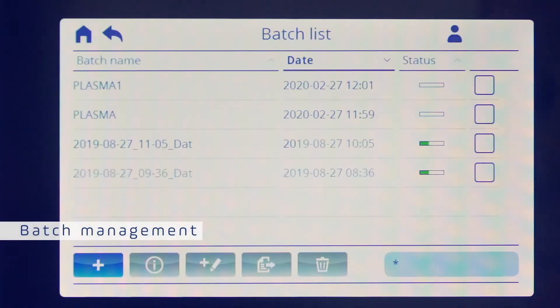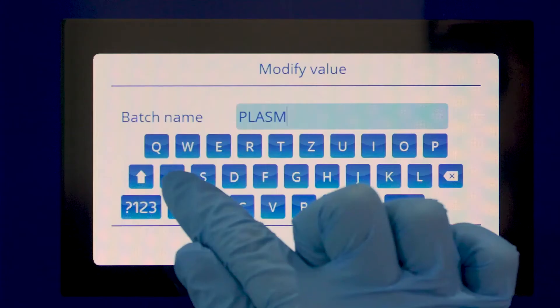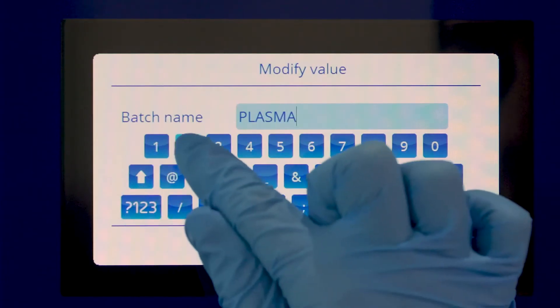To track the freezing process and record all data in one single file, use the batch management system and scan the barcodes while loading.